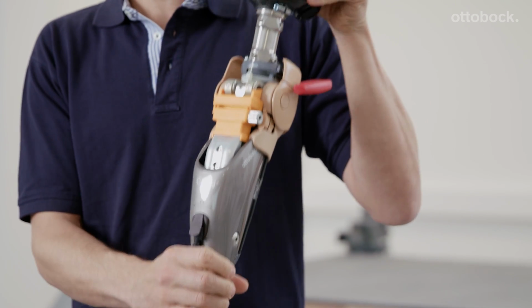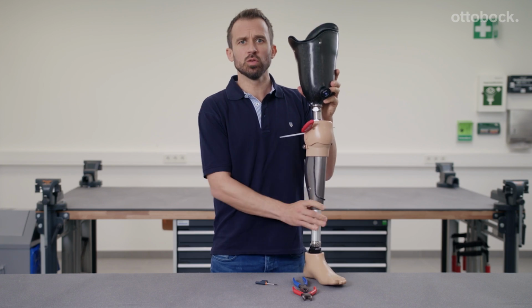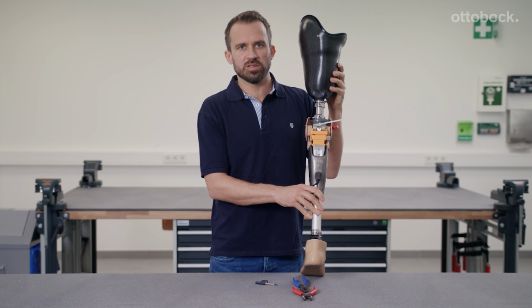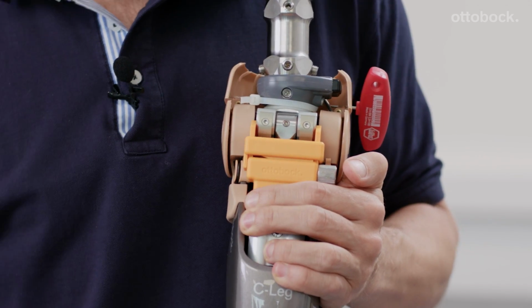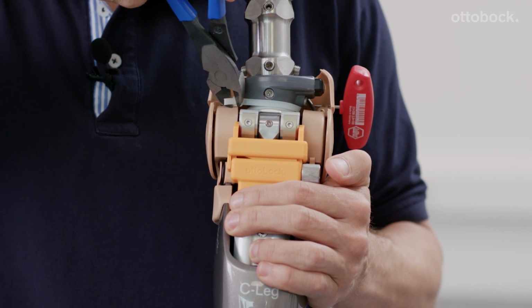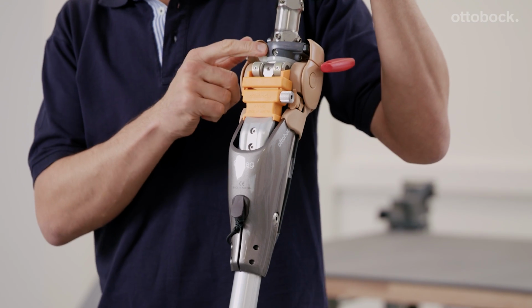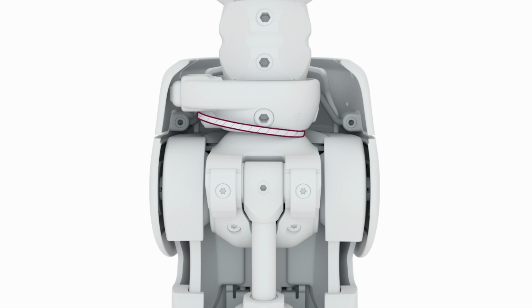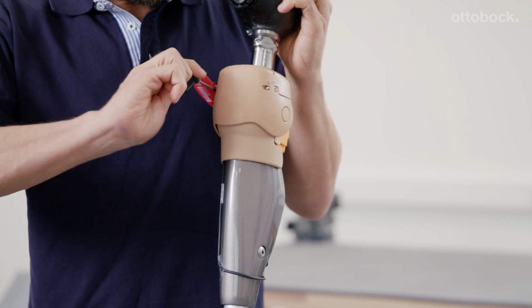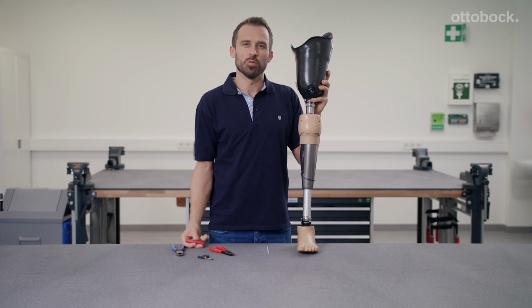Now bring the knee back to maximum extension. Just another reminder, please use the knee extender for the C-Leg 4 here. Now use a cable tie to pull the metal bracket firmly against the adapter over the knee joint. It's best to close the cable tie to the side and trim it. If you're using a rotation adapter as we are here, please remember to check the cable tie is properly positioned. Then use a Torx key to tighten the two screws. We've done it.